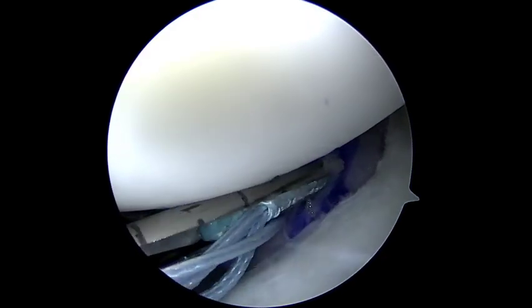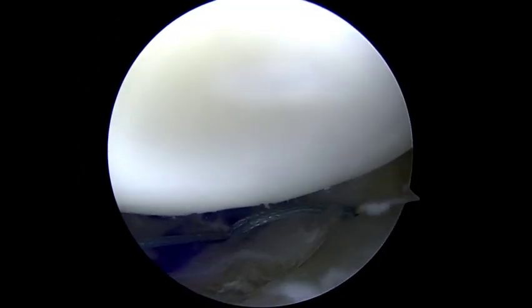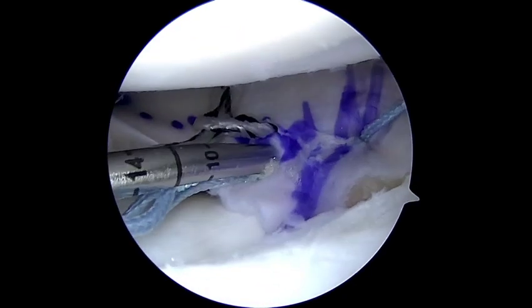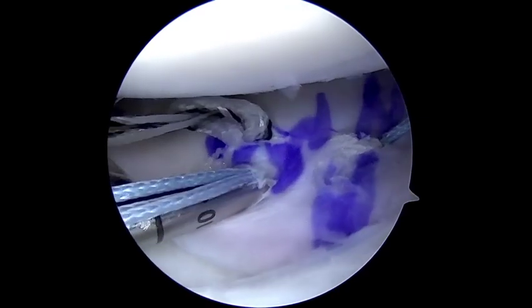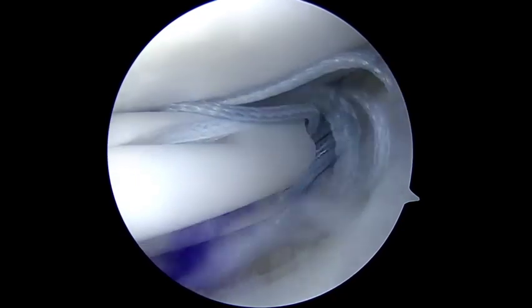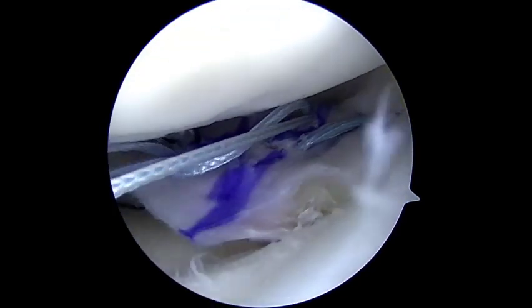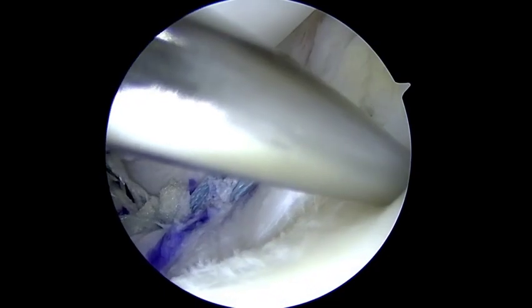Next, two fiber stitch all-inside implants are additionally used to secure the allograft to native meniscal tissue along the rim of the segmental meniscus. An inside-out meniscal repair is then performed to secure the meniscal allograft to the remaining native meniscal tissue and capsule.